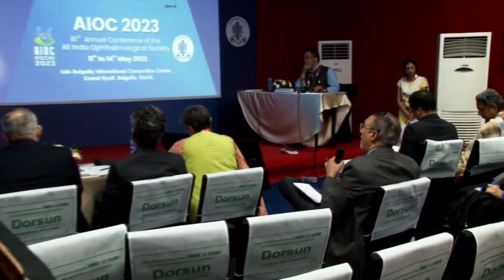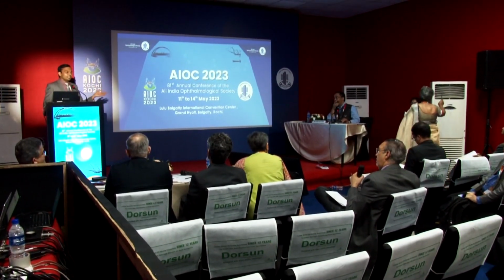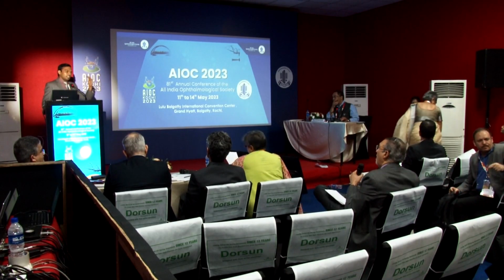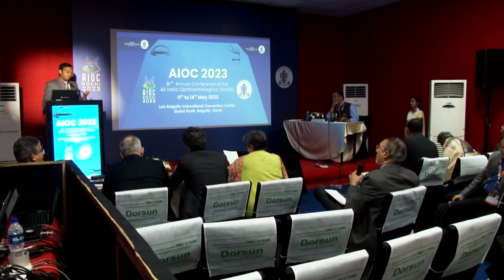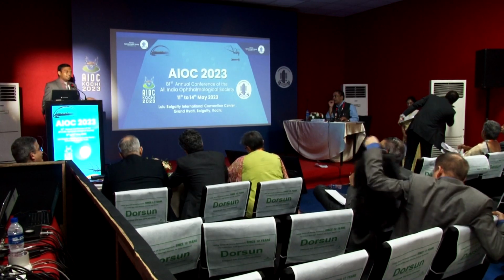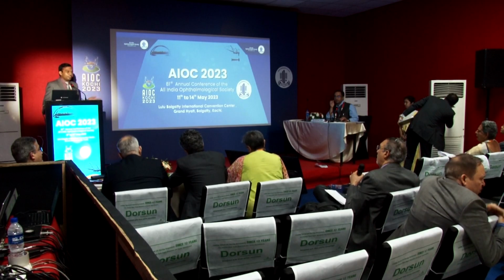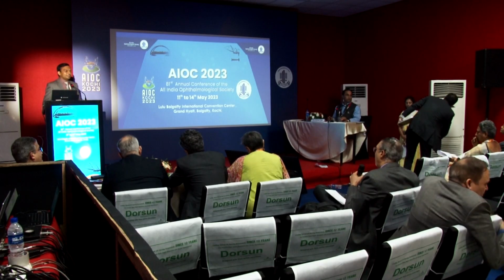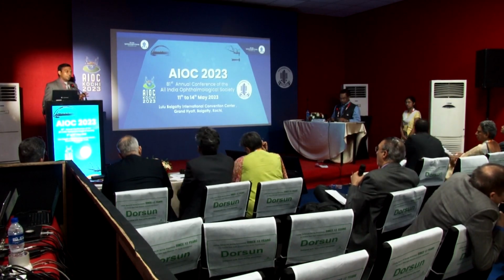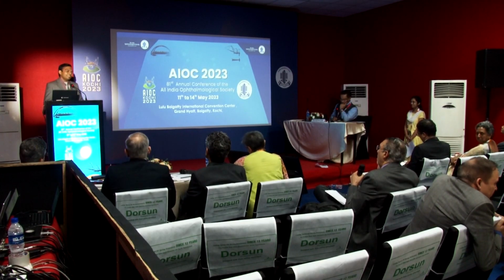Sir, what I would like to point out is that we found a discriminatory cutoff during our study between mild and moderate to severe, and between healthy and thyroid eye disease orbits. Our suggestion is that whenever the velocity values are below the cutoff, there is an increased risk for orbital ischemia and ischemic optic neuropathy. So decompression may help, but we would like to have a larger sample size and a longer follow-up, and we would like to correlate with the intraocular changes, whether actual ONH vascularity is altering after decompression or not, which we could not do as a part of our study.